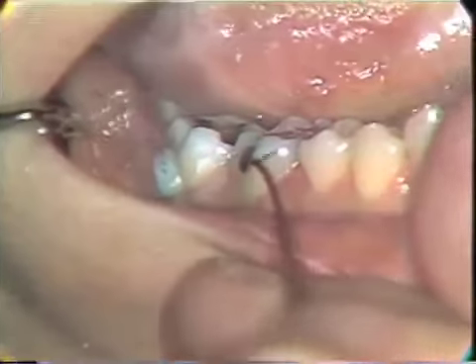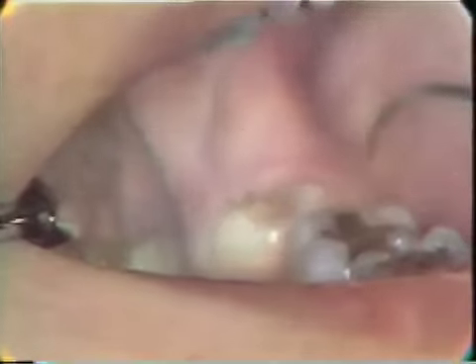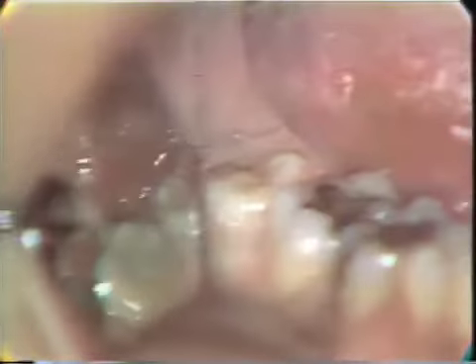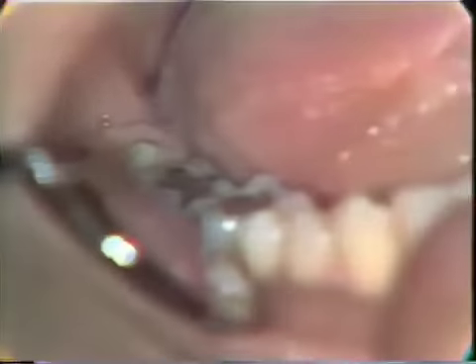them with your explorer. Now, as we continue, number 32 shows the gingiva is around that tooth, about halfway. Half the tooth is covered by gingival tissue, but there does not appear to be any irritation present. Now we can complete the form. We'll check and see if the patient has filled the form correctly.